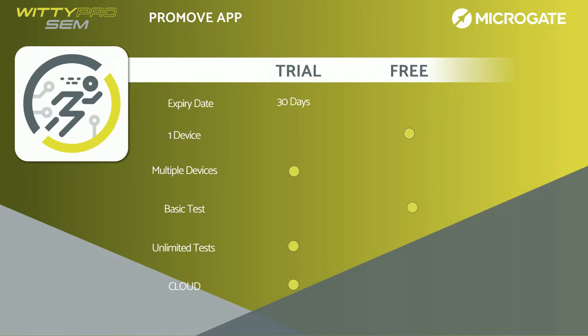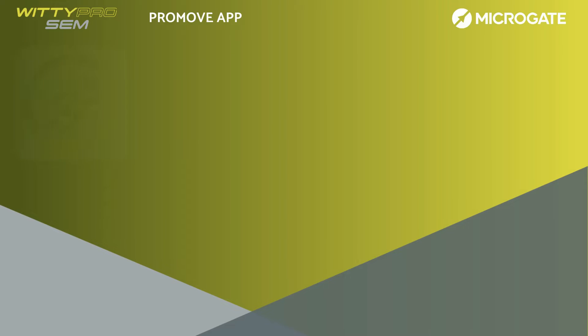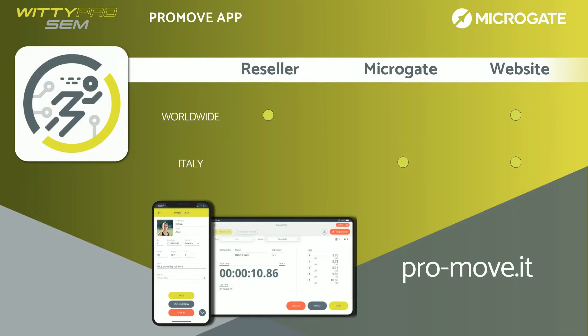At the end of the 30 days, the app will switch to the free license mode. This type of license does not expire and allows you to use the app in a limited mode only with WITI Pro, with only sprint tests and without cloud services. If you want to use ProMove with all features included, you will need to purchase the Pro version separately or together with a WITI Pro system, WITI SEM Pro, or both. The license can be for one or three years and includes all the features of the trial version. You can purchase the Pro license from an authorized reseller, directly from Microgate if your business is based in Italy, or directly from our dedicated website.